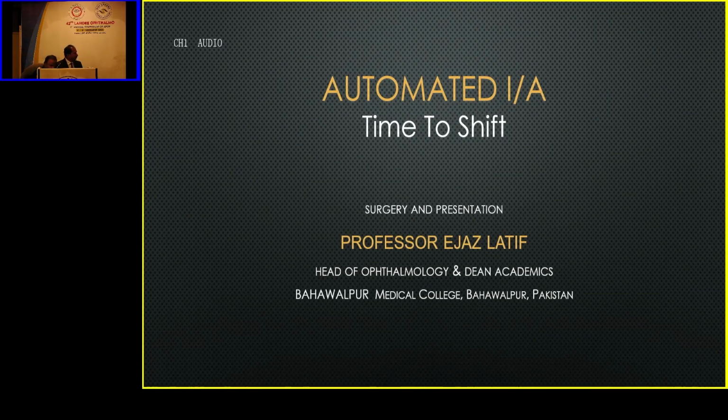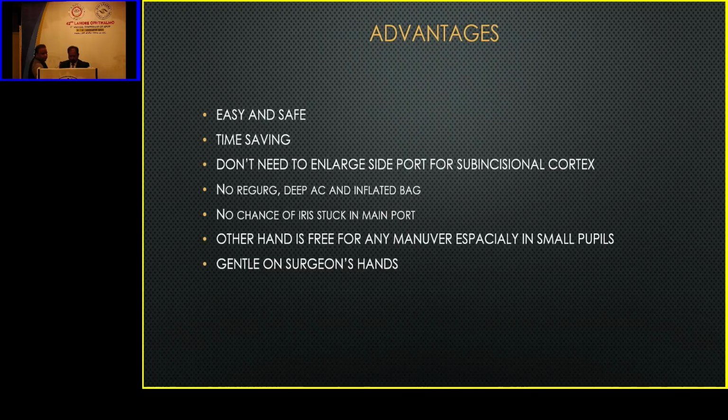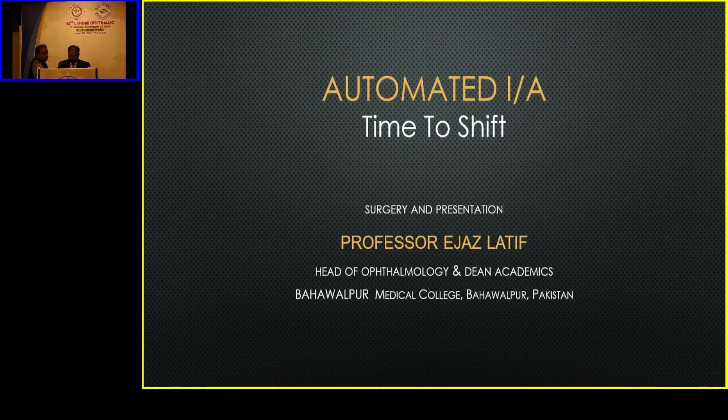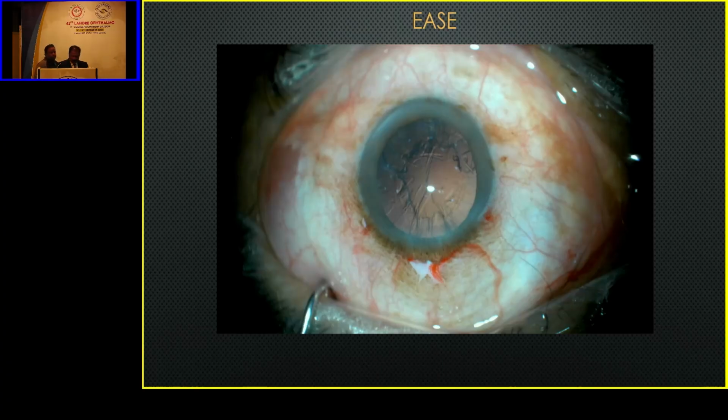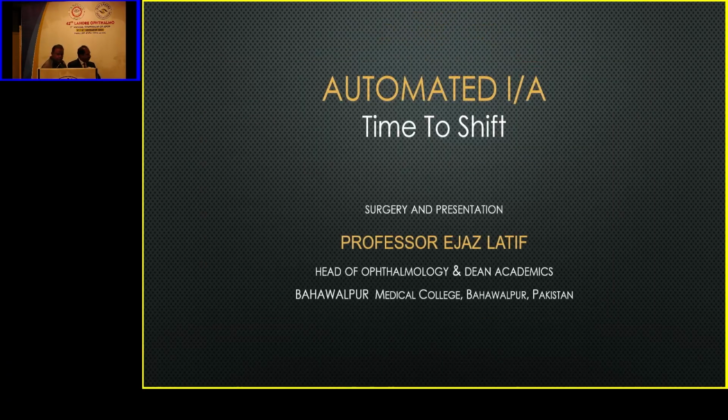There is the space of Berger. So we must know that there's a gap of around 3 millimeters behind the posterior capsule, where you can safely do the rhexis without disturbing the AVF. The younger the patient is, the stronger is the AVF. Yes, so even if you are dealing with a 360-degree subluxated lens, you can do irrigation aspiration to minimize your incision in doing IA of these patients.